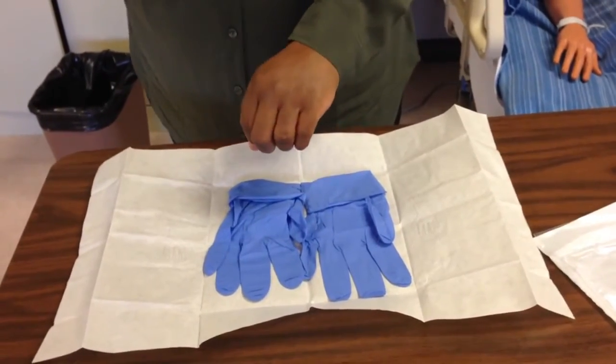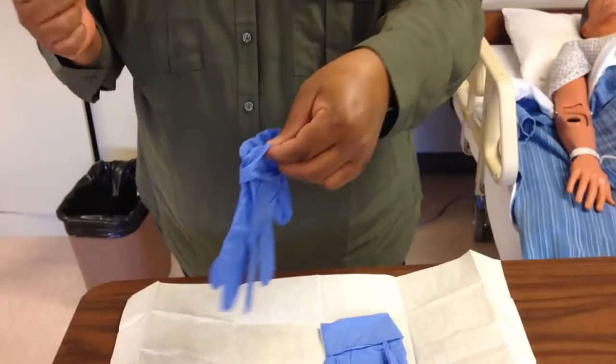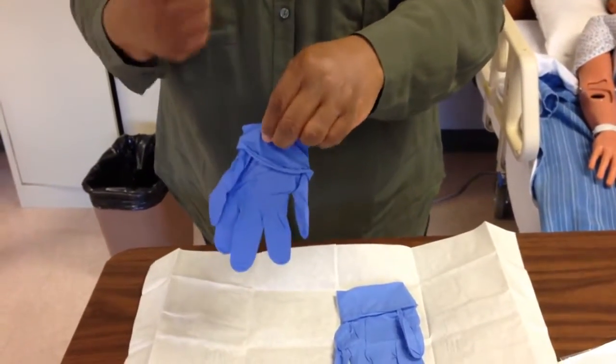I'm going to put on the right glove first and I can touch the cuff because that is the portion that will be next to my skin.